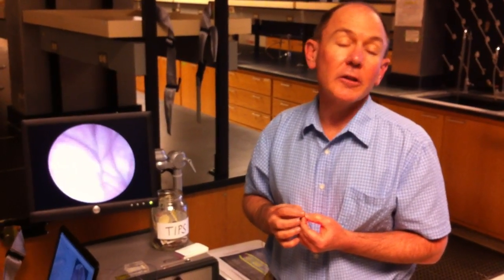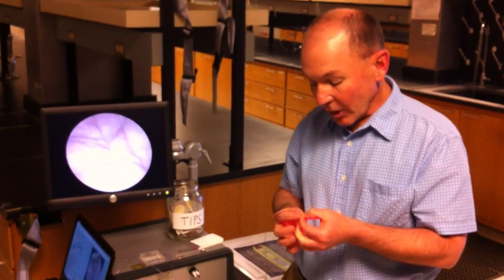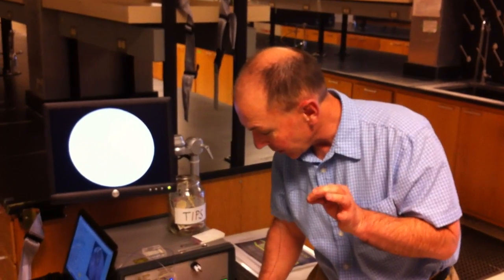So we're doing trials at the university hospital, into the bile duct. We've also taken this same device and repositioned it a little.